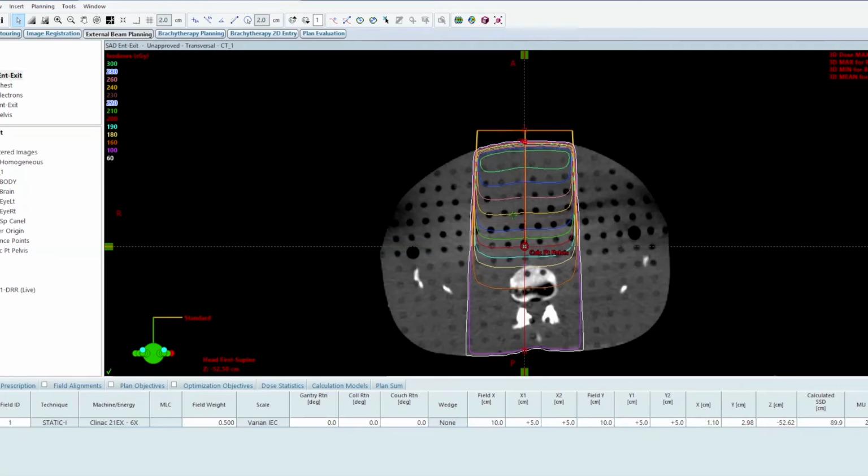In this podcast, I want to talk about SAD, entrance and exit dose. This is going to be similar to the SSD, but the physical dose calculation is quite a bit different. With SSD, the isocenter is set to the skin surface, usually at a nominal 100 SSD.